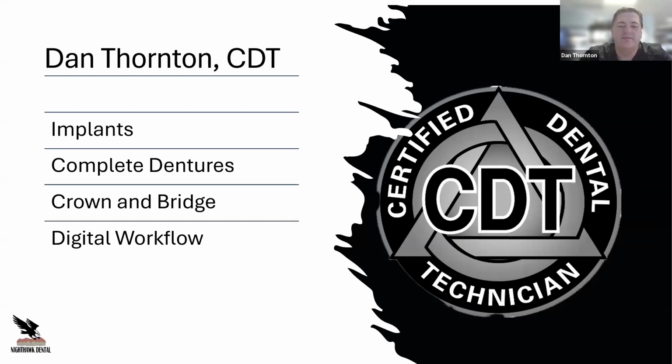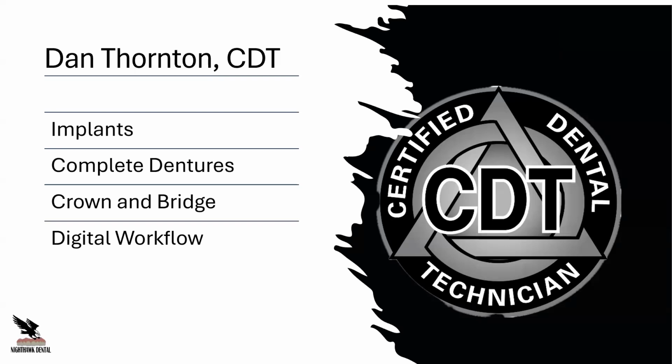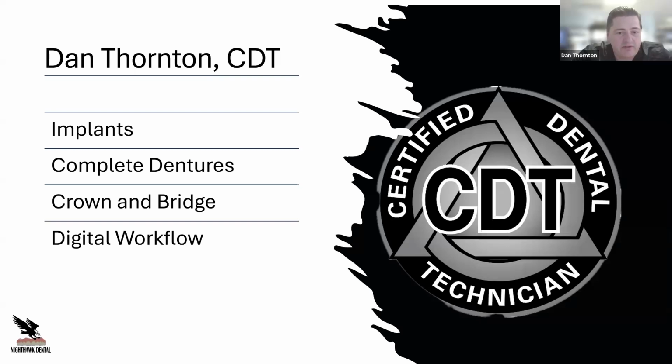The easiest way to get started with conversions, I would suggest, if you're talking with your doctor or your surgeon, is to find out what they want to do. If they want to do the stackable guide, it'll be a little bit easier on you, just for the fact that everything's going to be planned. It's going to be a step one, step two, step three process. If they want to do more of a traditional way, they don't want to do a guide, they want to do freehand, definitely get the smart conversion. It's going to make your life a lot easier. Watch the videos. The videos go over step by step how to do the smart conversions, and it makes it a lot easier for you to get started with it.